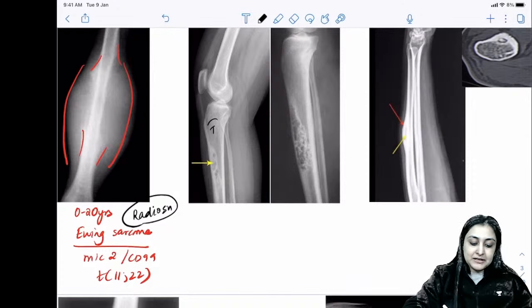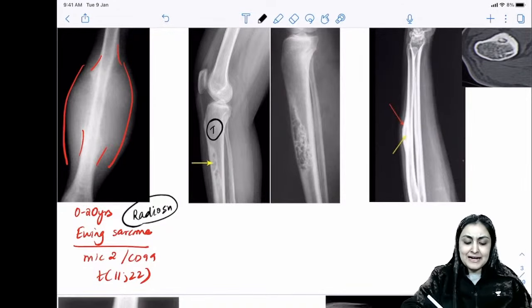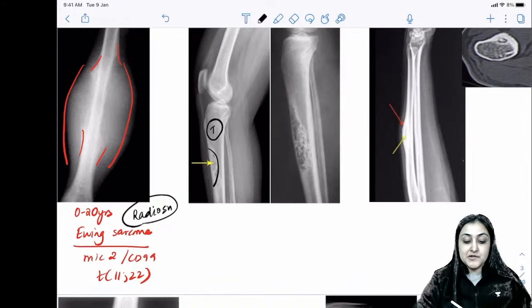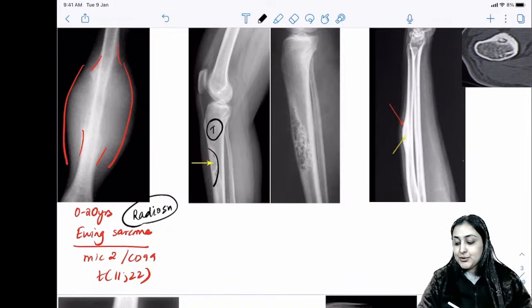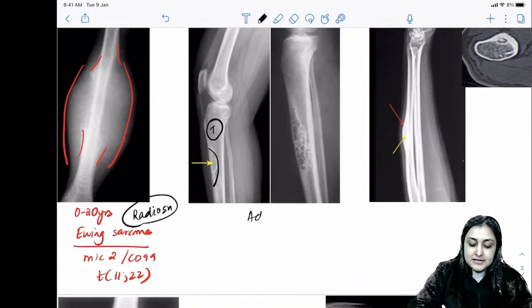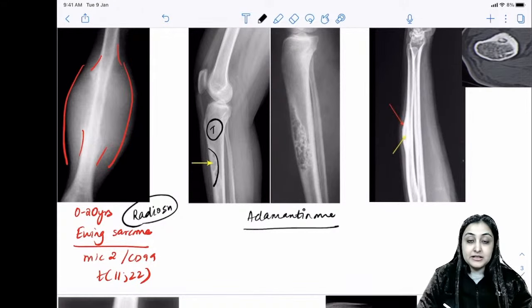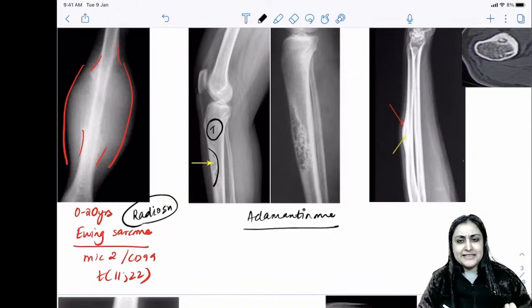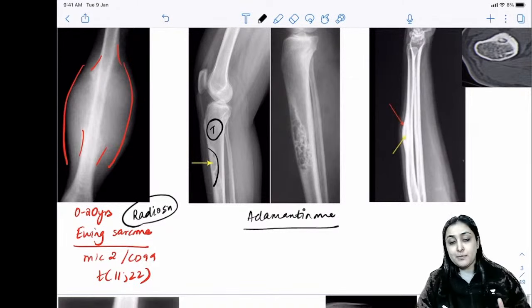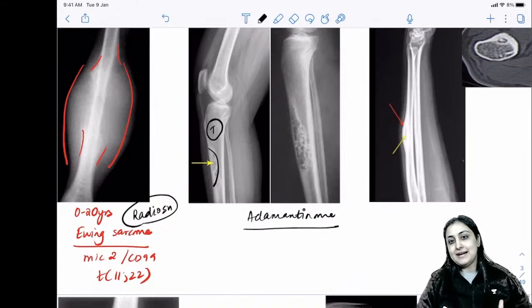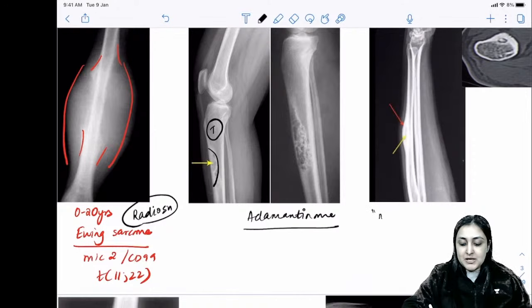The second diaphyseal tumor: when you see an eccentric anterolateral tibial mass with anterior predisposition, the diagnosis is adamantinoma. Adamantinoma has malignant potential. Remember: tibial lesion, eccentric, anterolateral — that's adamantinoma. You only need to diagnose it; not much more will be asked.